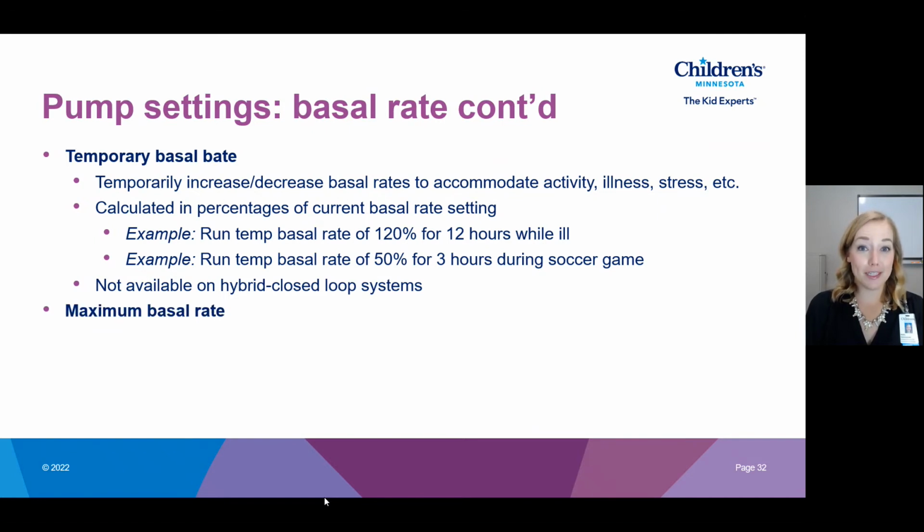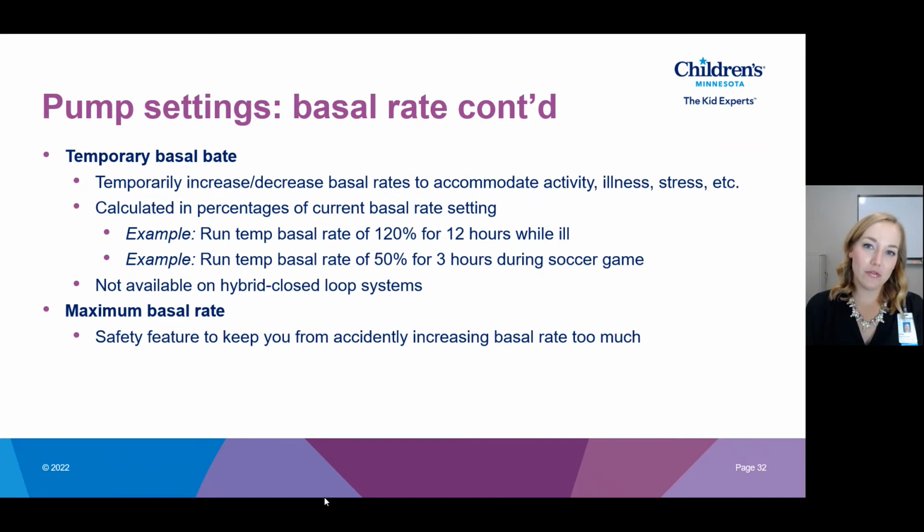Another setting is your max basal rate. This is a safety feature just to make sure that when you're setting a temporary basal rate, you don't accidentally increase too much. Our typical recommendation is just double your current basal rate.